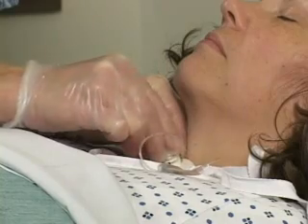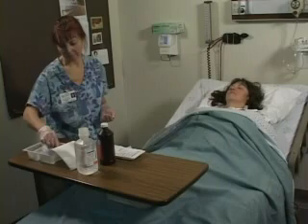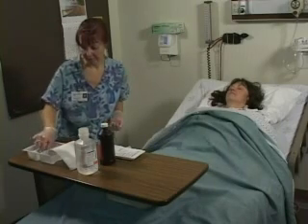If the tracheostomy tube has an inner cannula, then the sterile cleaning of it can begin now. Remove the inner cannula from the outer cannula and place it in a solution of hydrogen peroxide and sterile saline to soak. Nurses differ on whether they do this before or after the cleaning of the neck plate. The soak should not take but a few seconds, so either timing is good for the client.